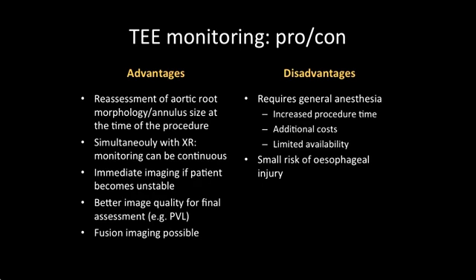The downside of TEE monitoring is the need for general anesthesia during the procedure. This is associated with increased procedure times, additional costs, and potentially a limited availability of the anesthesia team. TEE is also associated with a small risk of esophageal injury.